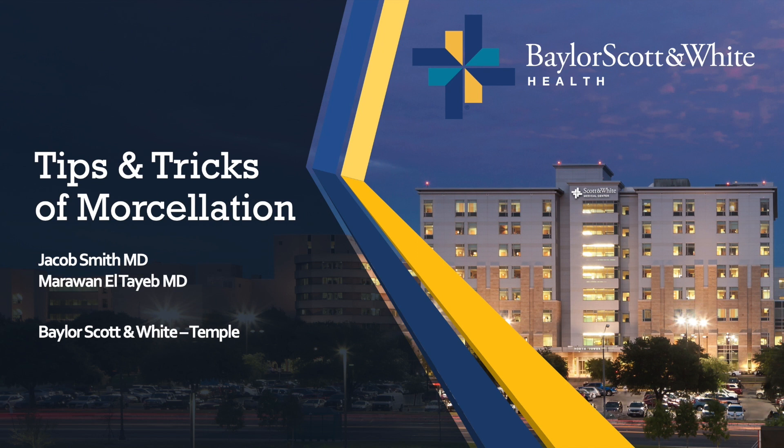In this video, we hope to provide some tips and tricks to standard and difficult morcellations.